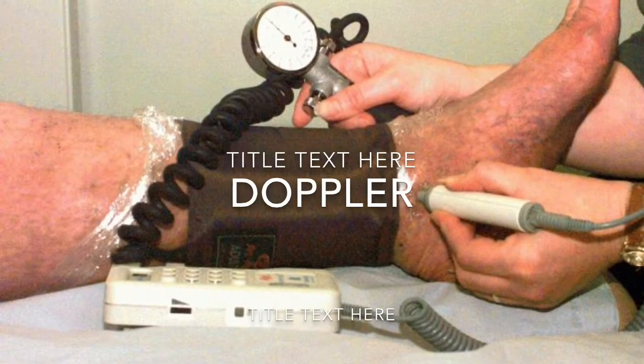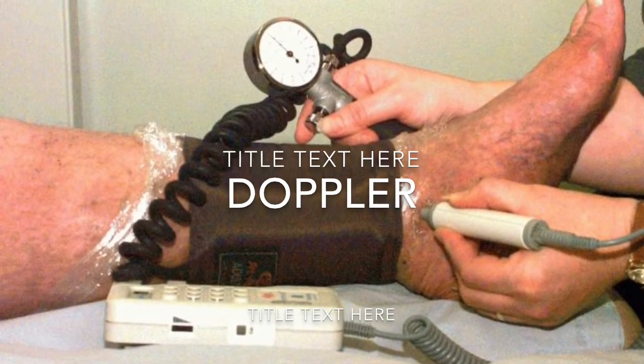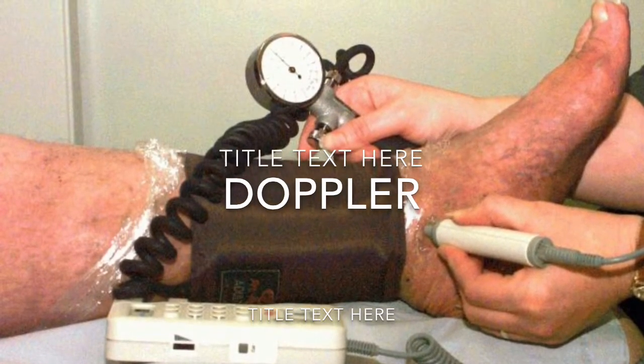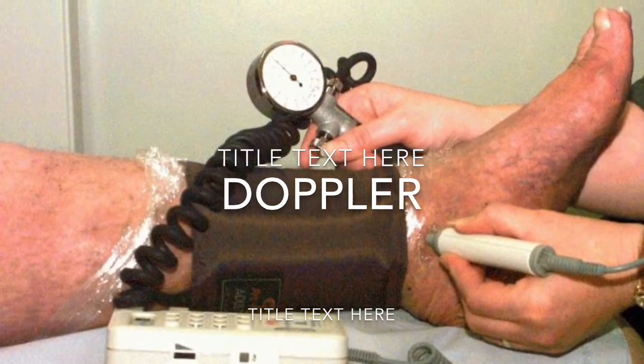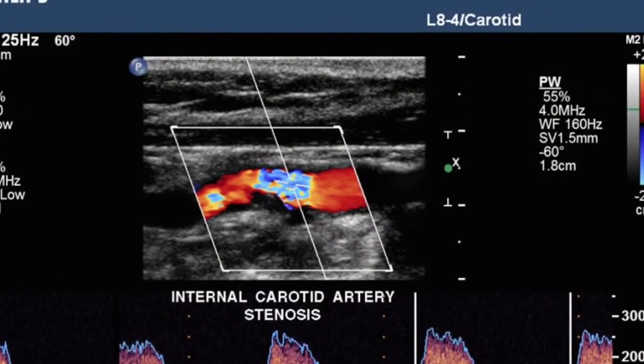This time we're gonna talk about Doppler. Doppler is a non-invasive way to detect blood flow and direction. When other features are added to Doppler, we can better describe gross anatomy and pathology of the examined vessels and the hemodynamic nature of the flowing blood, up to its velocity.